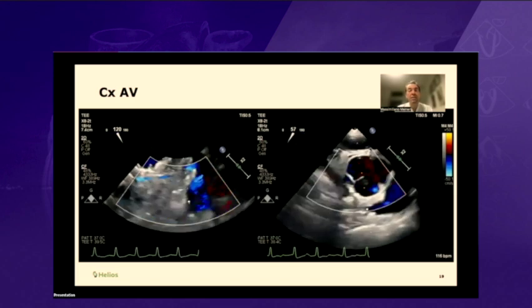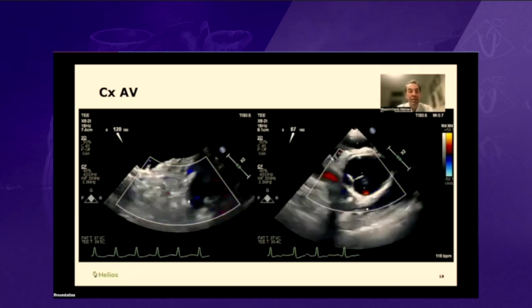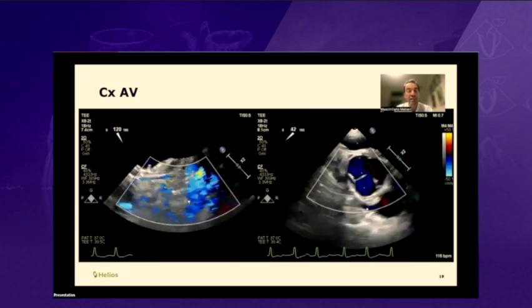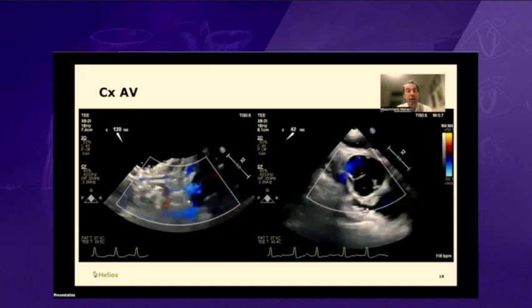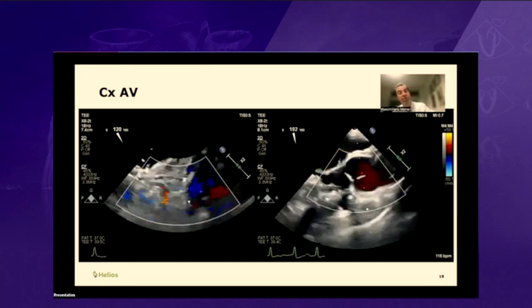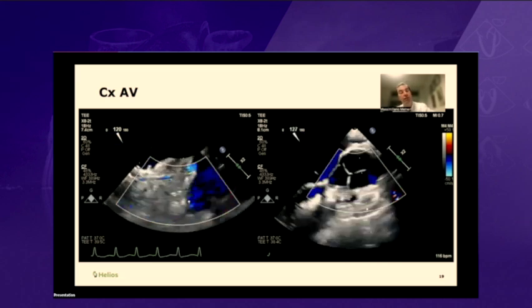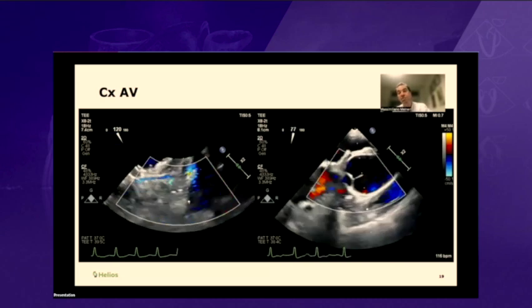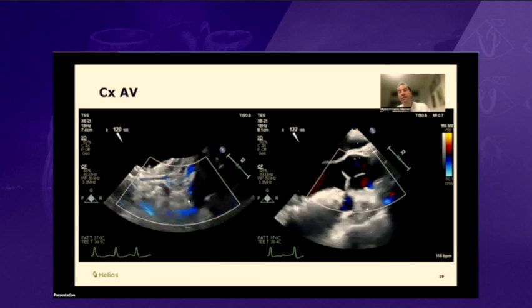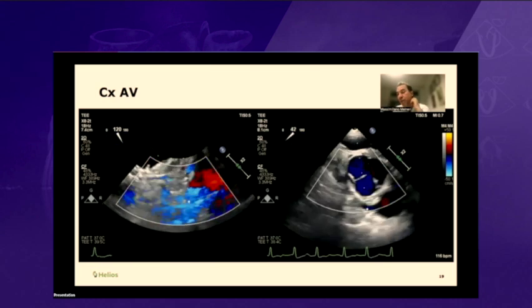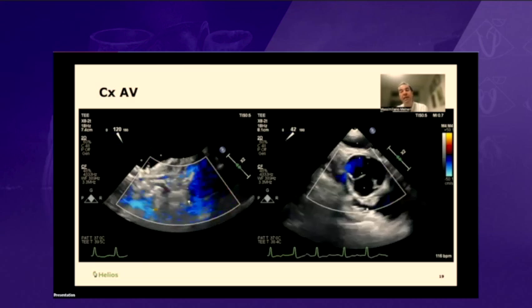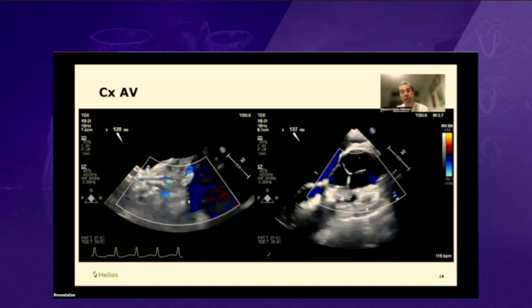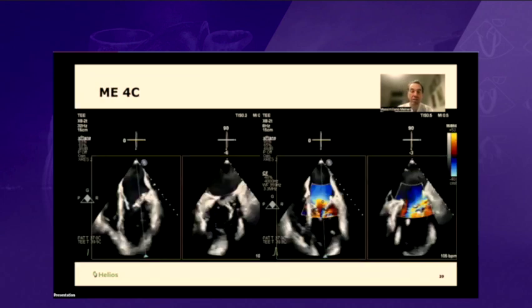Now we just released the cross clamp. With color flow, I can follow the circumflex all the way under the new ring that was placed. I demonstrated right away that there is flow in the circumflex. The heart started to beat, but the heart is empty and not pumping. I checked the aortic valve for regurgitation — there is none.